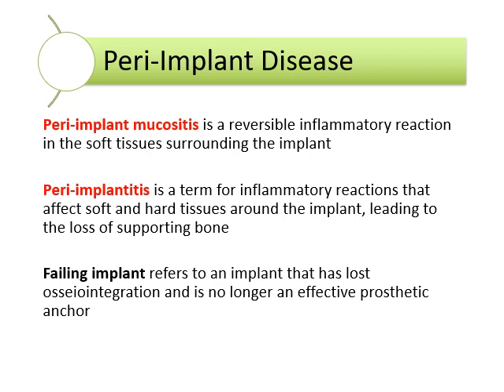So plaque biofilm is the primary factor in peri-implant mucositis, again, just like with gingivitis. We want to clean around the surfaces of our implants, just like we clean around our natural teeth. We want to do complete debridement, surface decontamination, and we just want to make sure that the implants and the gingival tissue around the implants are staying just as healthy as our natural teeth.